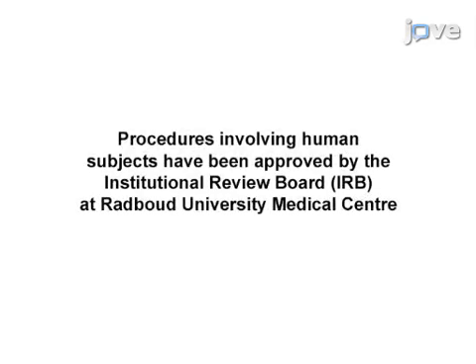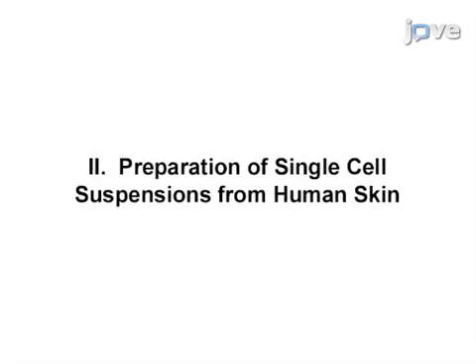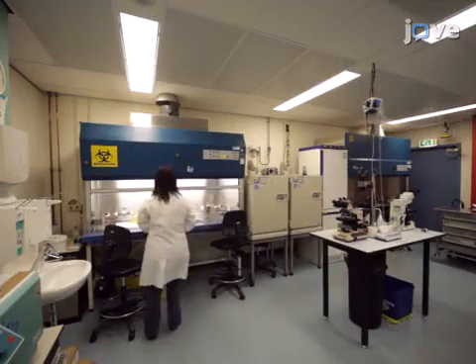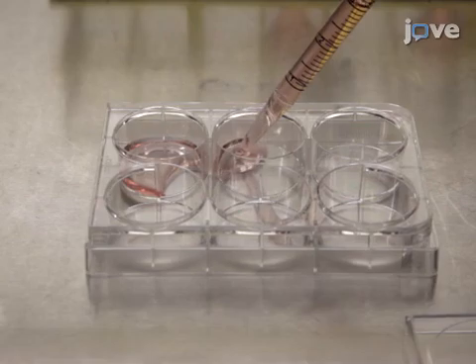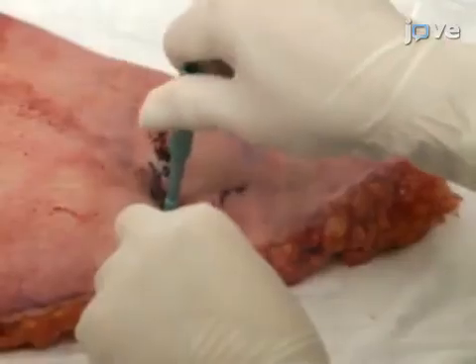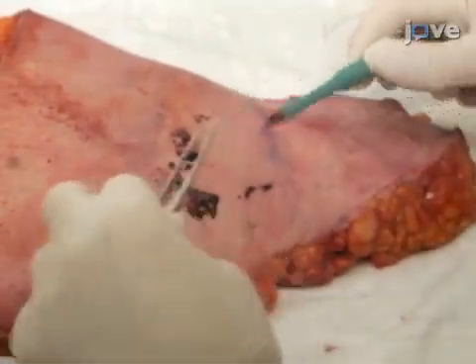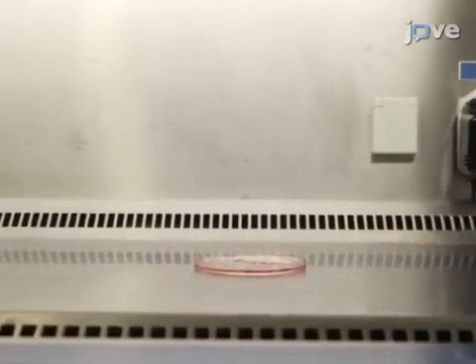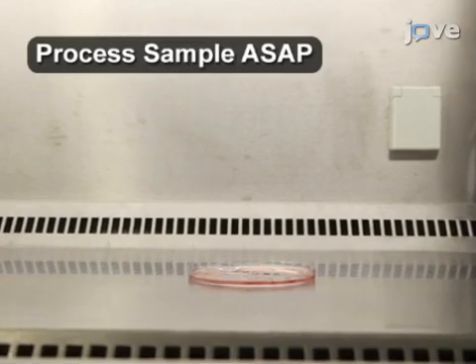After preparing culture medium according to the text protocol, add two milliliters of complete medium to three wells of a sterile six-well culture plate. Then use a four millimeter round biopsy punch to obtain a skin biopsy. Place it in RPMI 1640 complete culture medium and leave them on the bench for up to four hours or at four degrees Celsius overnight.